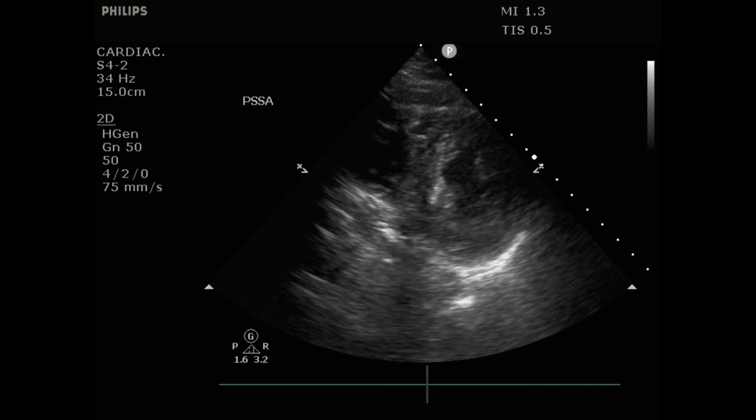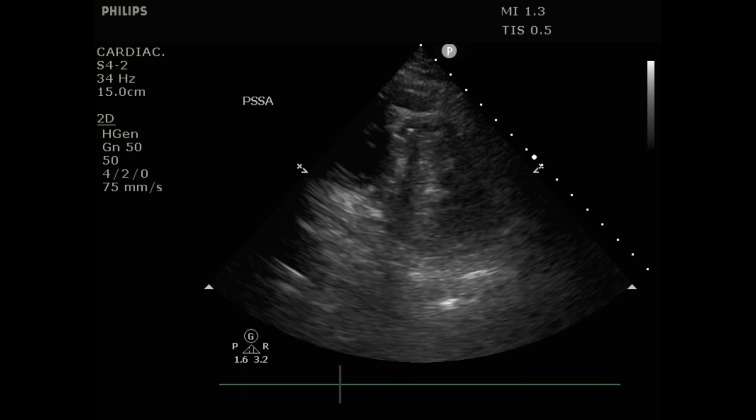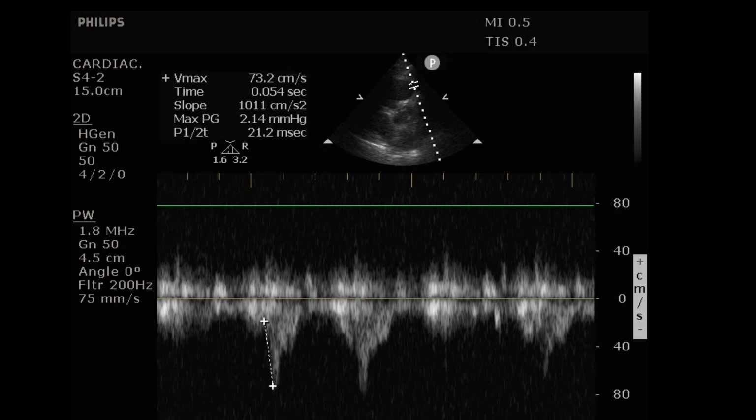And if you want to go a little more esoteric, a little more complex, there's the 60-60 sign for PE; we have a video on that on the YouTube channel. If you do the 60-60 sign, you want to get a pulmonary outflow tract Doppler to look at the acceleration time. It's going to be up here, right? You go in the parasternal short, really high up by the base, getting the blood coming out of the right ventricular outflow tract into the pulmonary valve. You're going to do a Doppler there to get your acceleration time.